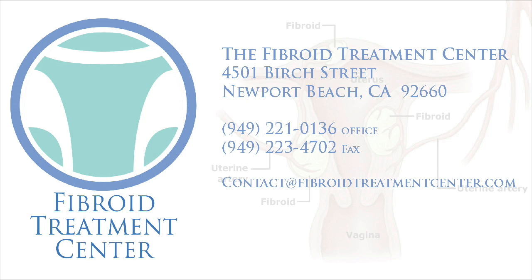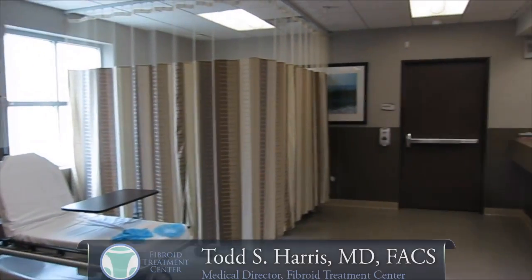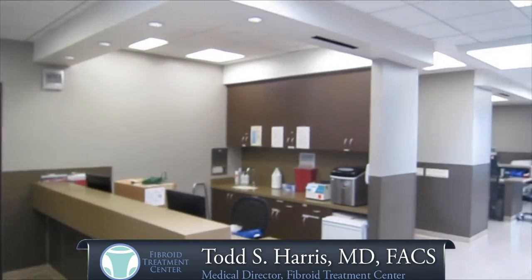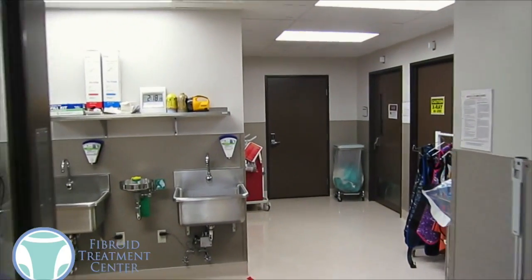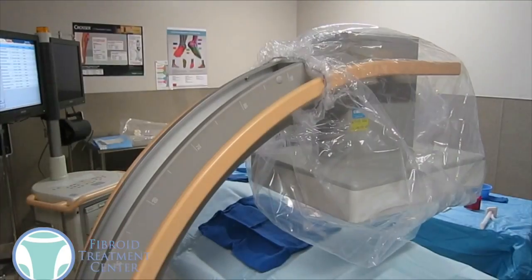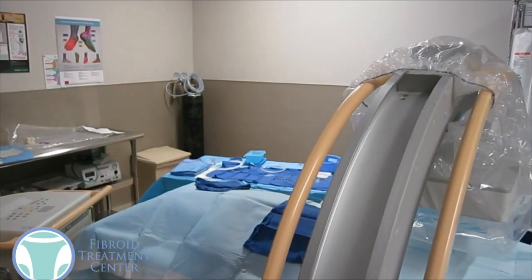This is Dr. Todd Harris from the Fibroid Treatment Center. A lot of women ask us what exactly is entailed with the uterine fibroid embolization, so we wanted to walk you through one. A woman would get checked in here in the preoperative area, she'd have an IV placed, she's wheeled back to a procedure room adjacent to the preoperative area. Once in the room, IV sedation is given so the patient will be more comfortable.